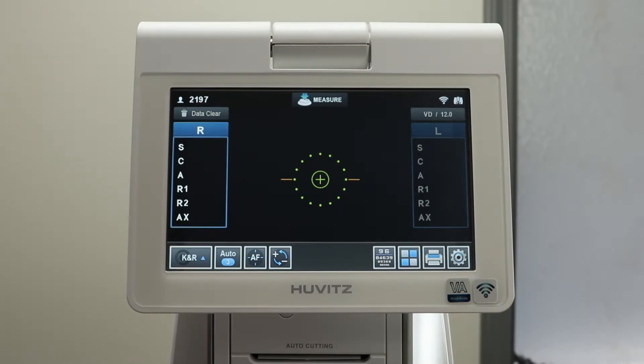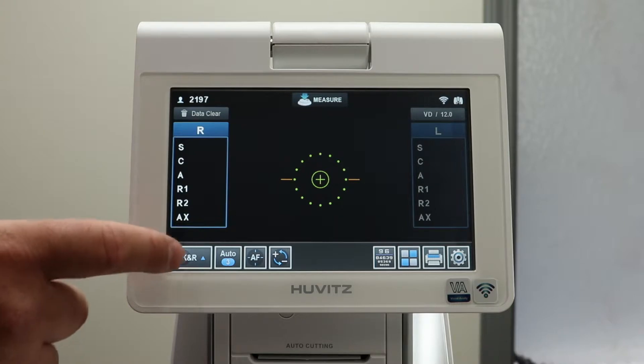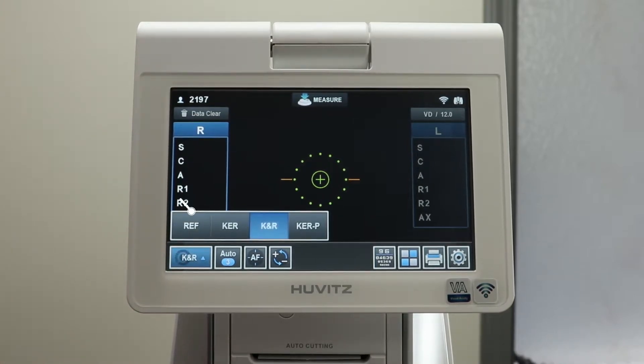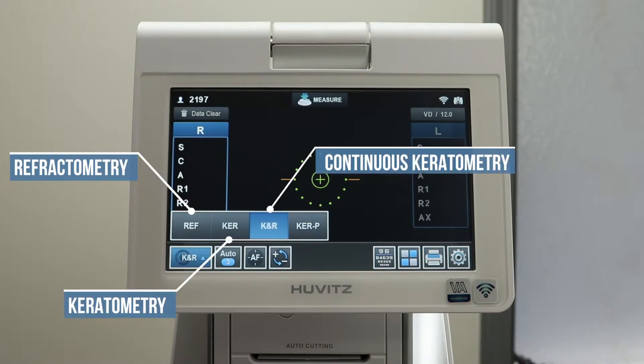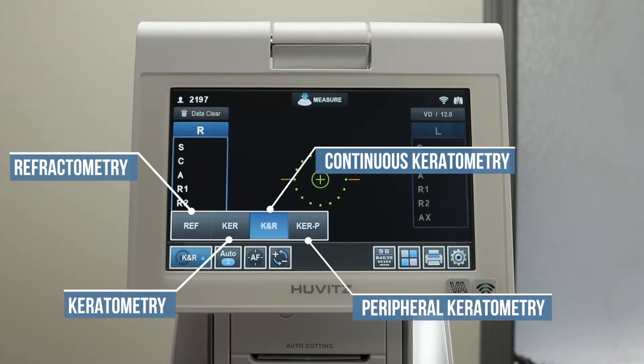On the main screen, you will have a number of features to aid you in examining your patients. At the bottom left corner is a menu. Click this menu to choose between refractometry, keratometry, continuous keratometry, and peripheral keratometry.